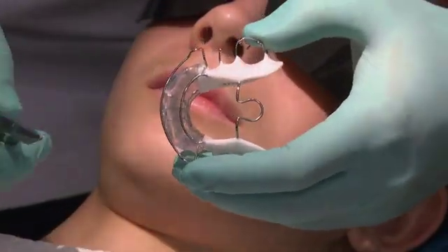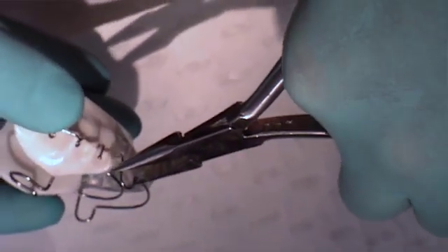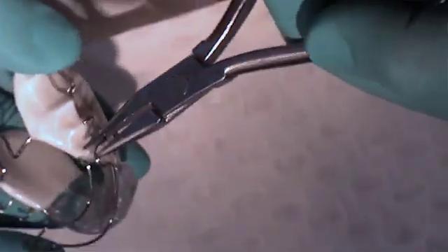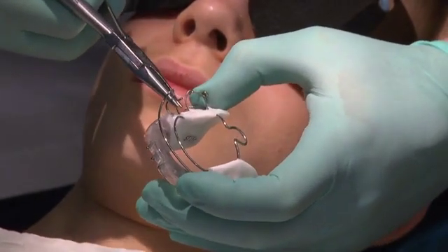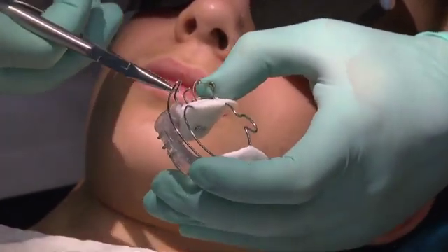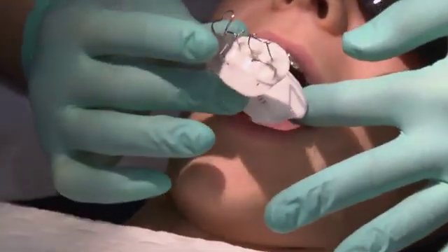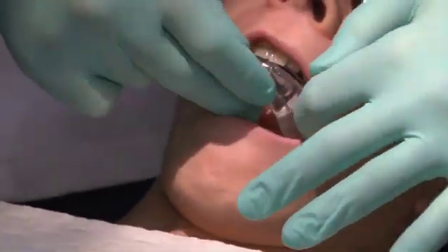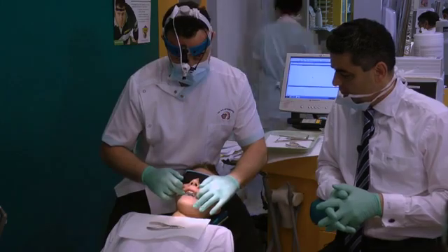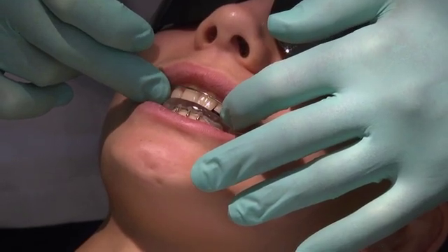For the labial bow, we activate like so — pulling in the labial bow more lingually. Also be careful about the torque of your incisors; in that case you reverse the bend by pulling back this way. So we pinch once and draw back. When it goes in, the patient opens into it, postures into it. Make sure we look at the incisal ledges and confirm they're all seated correctly into the acrylic.